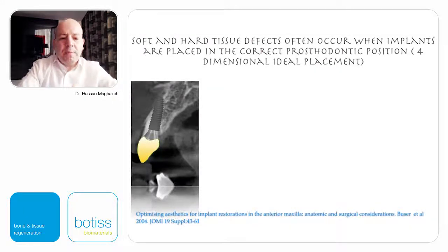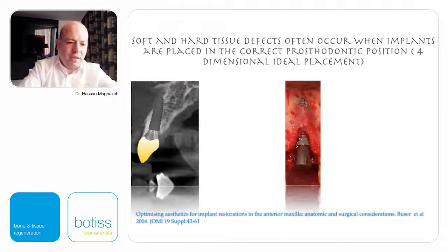So to summarize, you place the dental implant as an extension of your prosthetic envelope. If you're serious about your aesthetic implant dentistry, this is something you need to have as your primary priority. Place your dental implant within the prosthetic envelope of your future tooth. Make sure that you get the correct emergence profile, right? Placing the implant too lingual will give you a ridge lap emergence profile. Placing the implant too labial will give you a too convex labial profile. Both of these will give you bad biological integration.